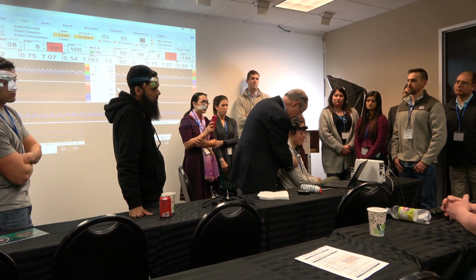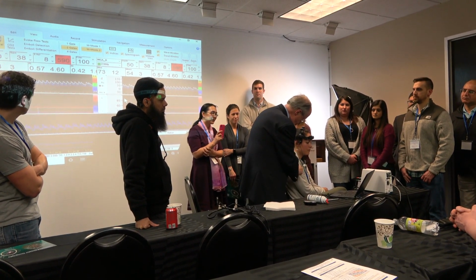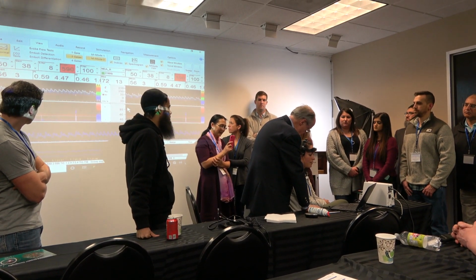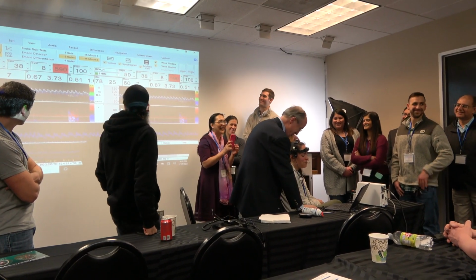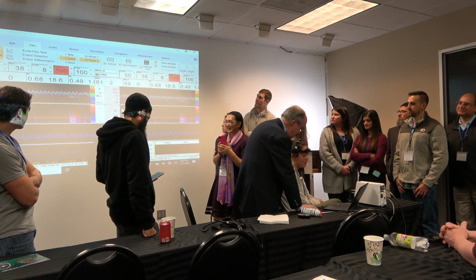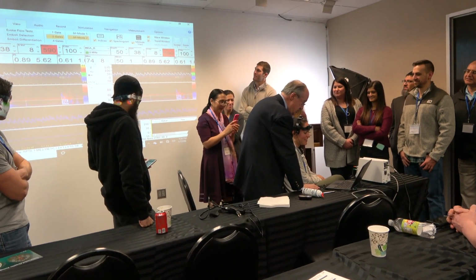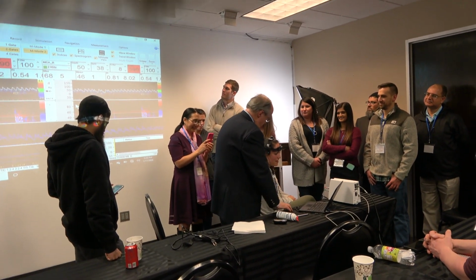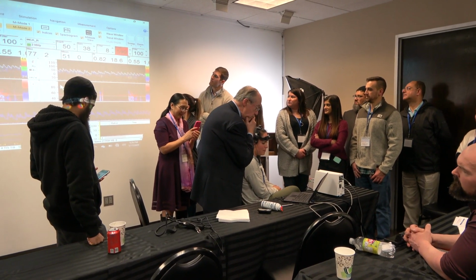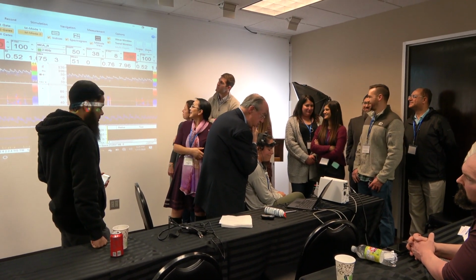So when I was saying, just hold your breath, but don't do it. Hold your breath and push down. No, I was already doing it. Sorry. Okay, let's start again. Just push down. I was already doing it again. I'll do it again. So just do. And look at the waveform. Head down, head down.